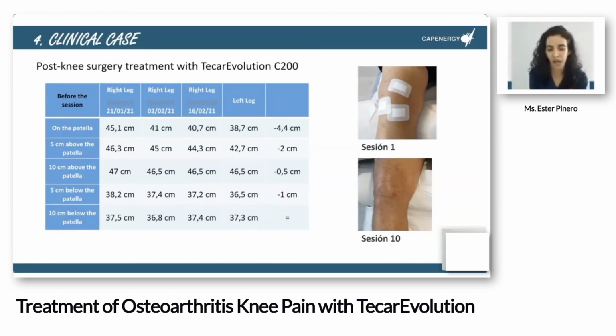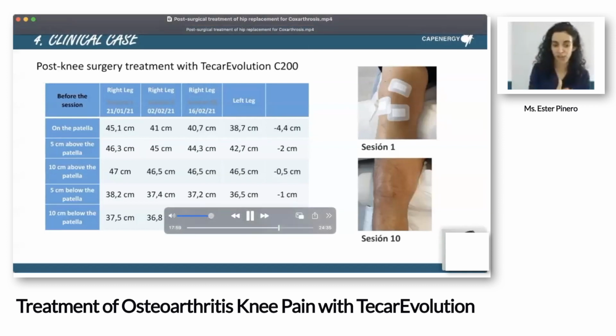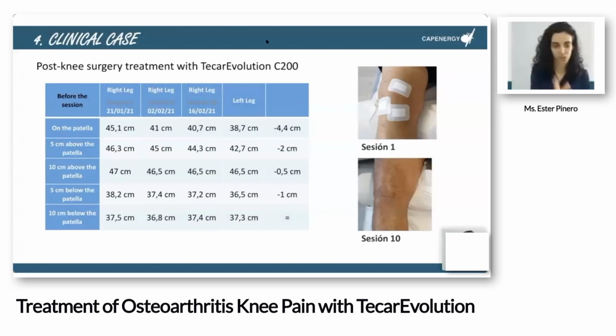And here you see how it's reduced the inflammation. The important thing I put on the right column, the difference between the first and the last session. And you have here also, Karina compares you with the left leg, the right back one. Then the important thing I want you to know here is that the big decrease of the inflammation of the leg is not till the 3rd week. It's in the 2nd week that we see this big reduce of inflammation.